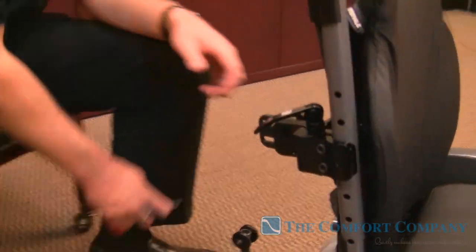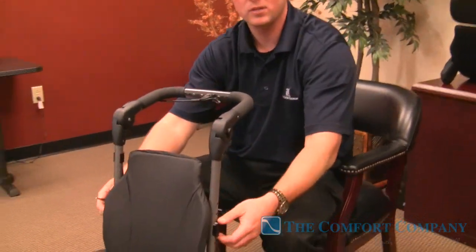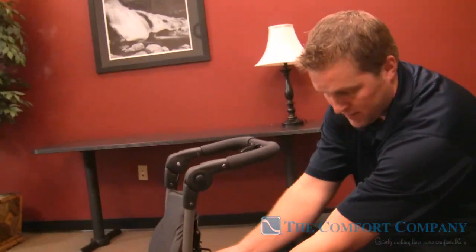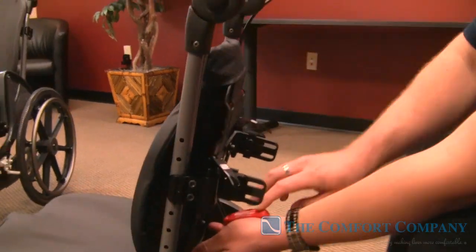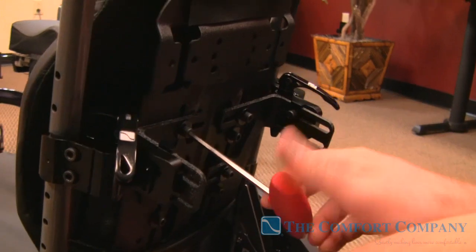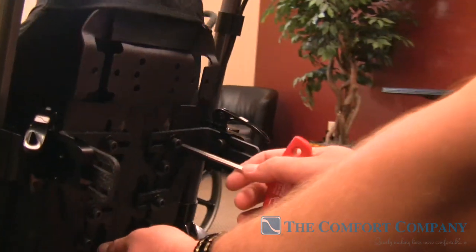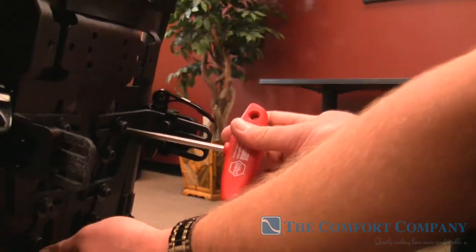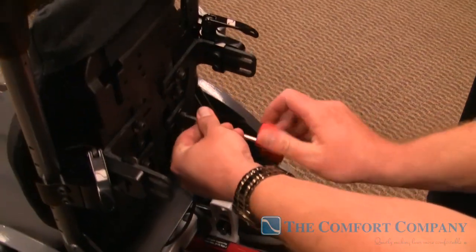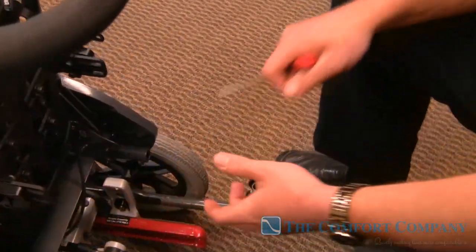Once we figure out our back height, we can adjust it either with the canes — loosen these up and move them down — or everything can be done from the back as well. We have a couple of bolts here to adjust back height. By tightening down one bolt, we lock in the height of the back. Then we can snug these bolts up — and the bolts themselves are a great selling feature of this back.